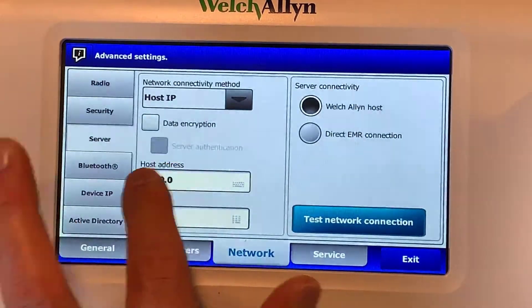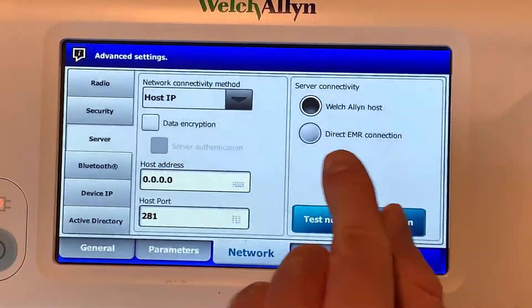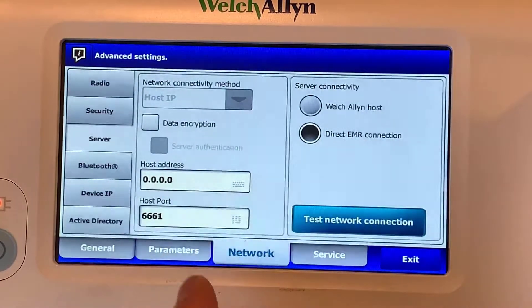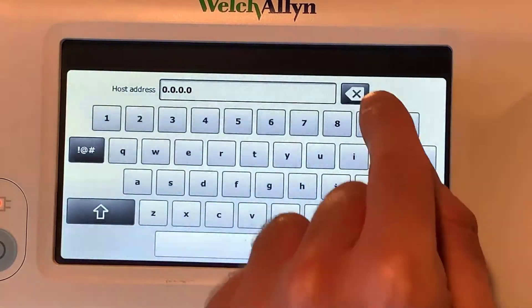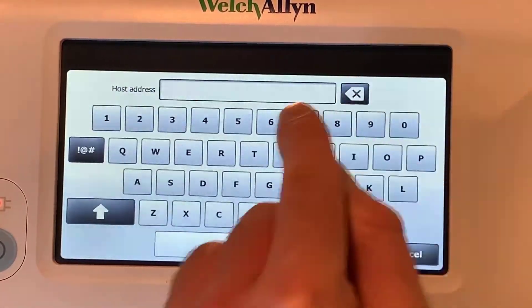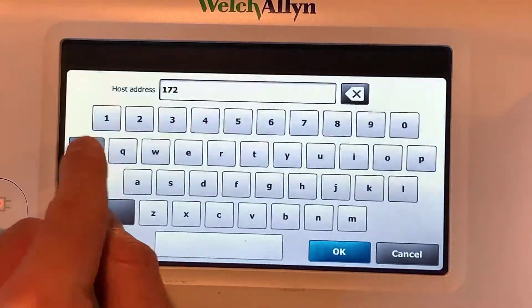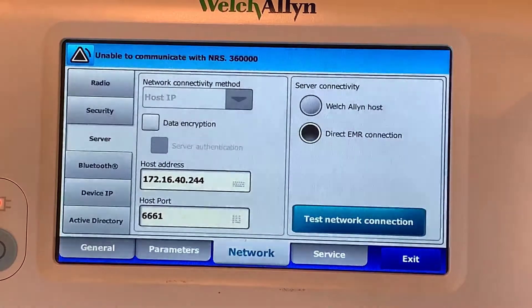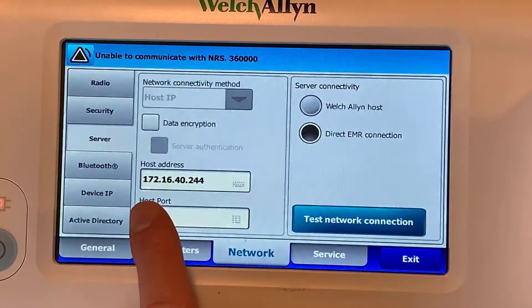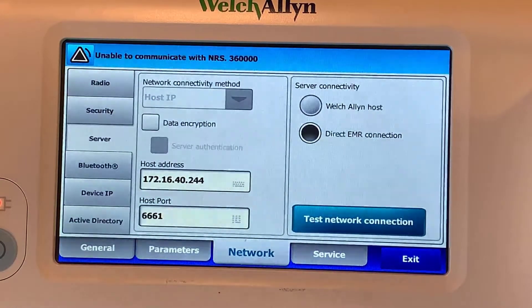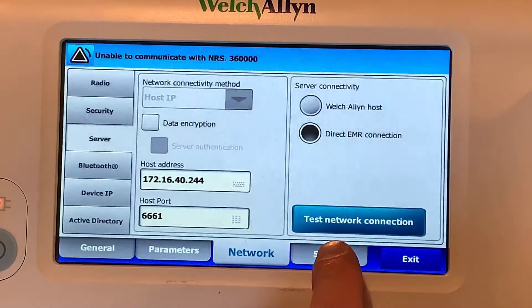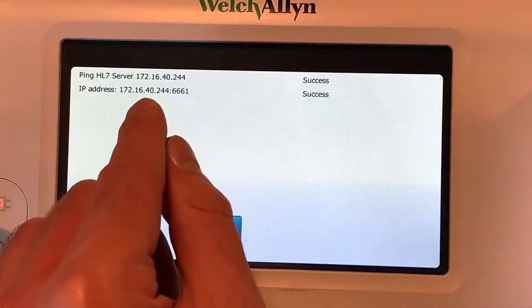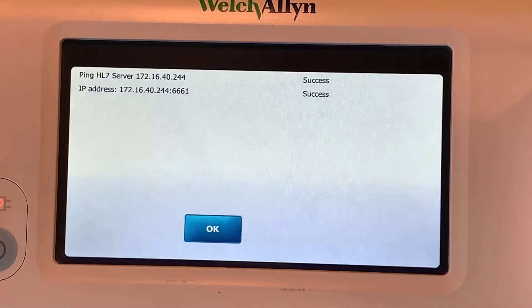I'm going to go to server, then host. Actually, before I do that I'm going to go to direct EMR connection, click on that, and then change the host address to match our virtual machine. So that matches the IP address of our virtual machine. Then I can hit test network connection. You can see it's done two tests and both have come up as successful.